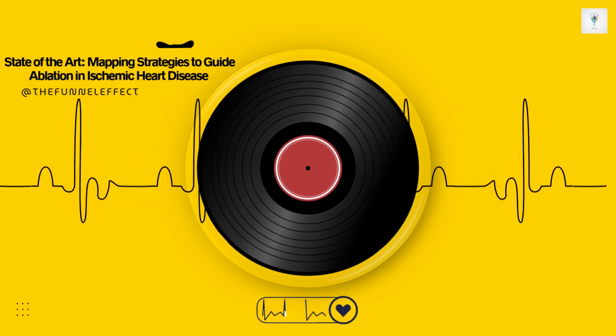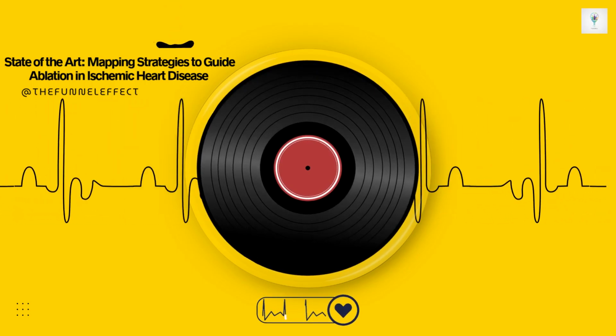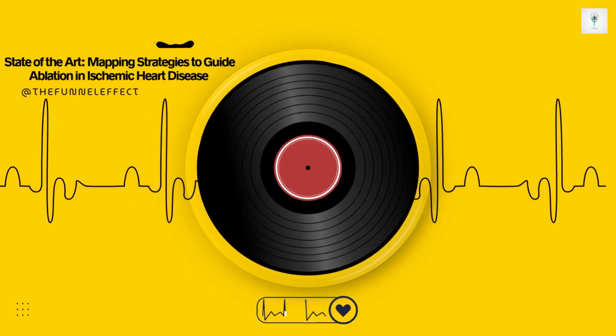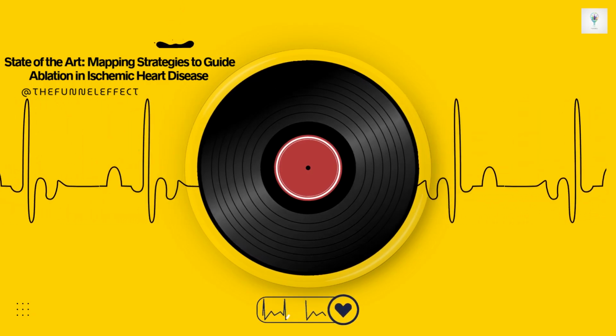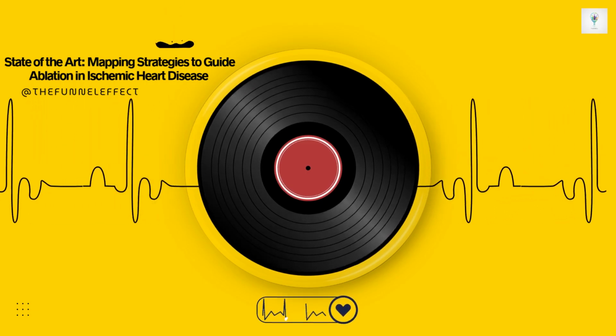Okay. And within these scarred areas, you sometimes find regions with extremely low voltage, like below 0.5 millivolt, often called dense scar. Can we just assume that tissue is completely dead and ignore it? No, and the review is very clear on this. Calling it dense scar can be misleading. Yes, these areas often correlate with the thinnest parts of the heart wall.